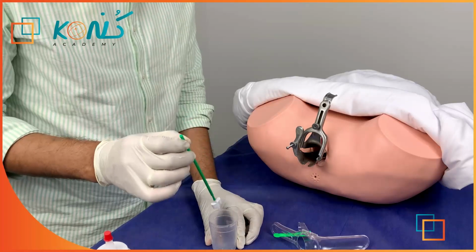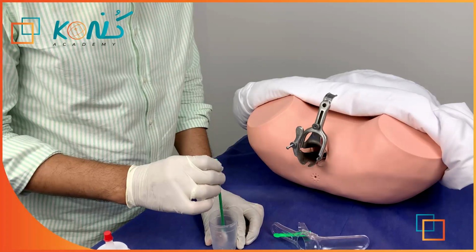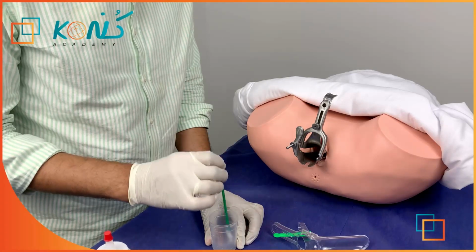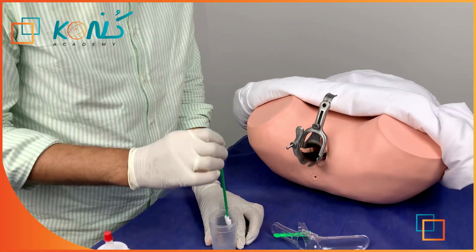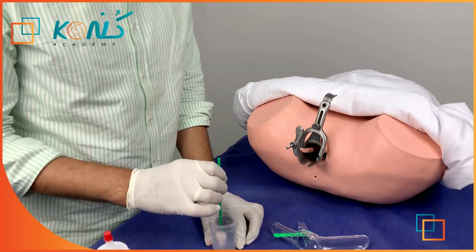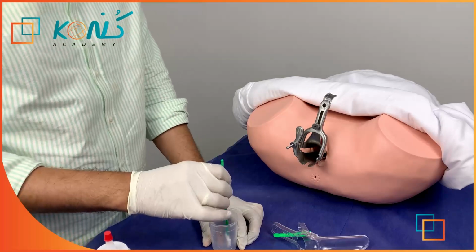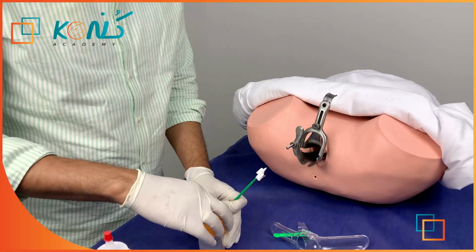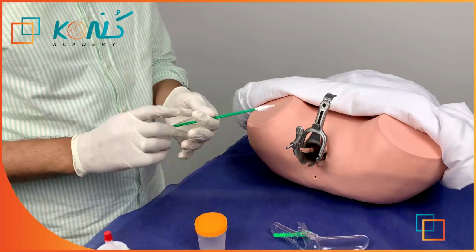How to do it? We will open the container, put the brush in like this, and hit the brush 10 times at the base of the container. 1, 2, 3, 4, 5, 6, 7, up to 10 times, to let the cell lining fall down. The different technique to get the sample after taking it from the cell lining is named SurePath.